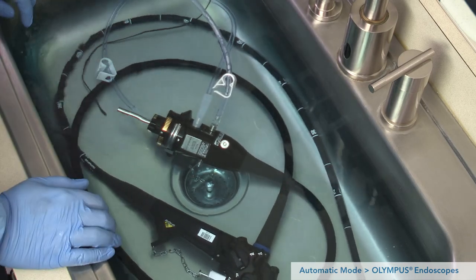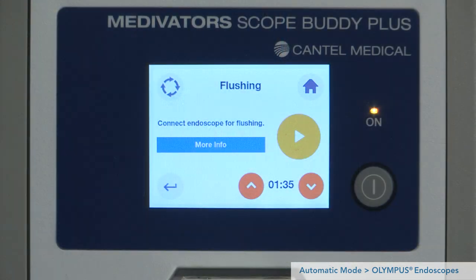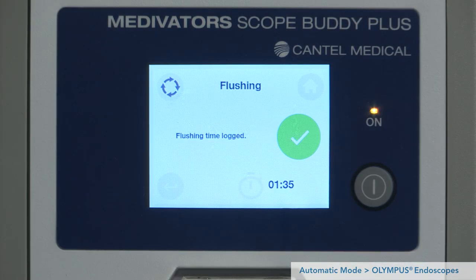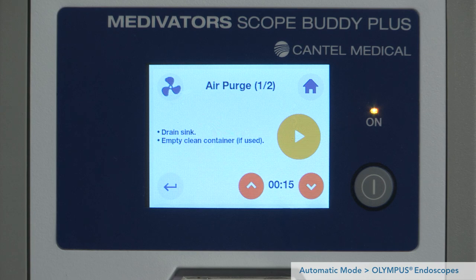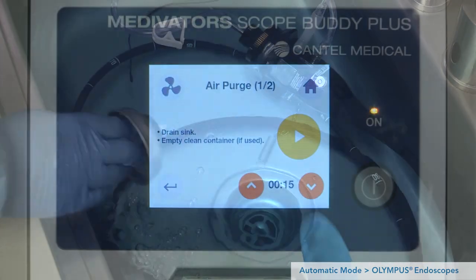We are ready to begin flushing the endoscope. The flushing step draws detergent from the clean container into the endoscope channels. Submerge the pump tube strainer into the clean container. The default flushing time is 1 minute and 35 seconds, validated by Medivators to cover worst-case flushing times for all endoscopes. Press play to begin flushing. Verify that fluid is exiting all channels of the endoscope during flushing. The first air purge step runs the pump for 15 seconds to push air through the endoscope to expel the detergent solution. Prepare for the air purge by lifting the pump tube strainer out of the fluid and releasing the plug to drain the sink. Press play to begin the air purge.